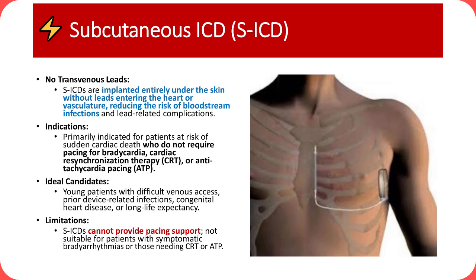However, a major limitation is that they cannot provide pacing support, making them inappropriate for patients with symptomatic bradyarrhythmias or those needing cardiac resynchronization therapy or anti-tachycardia pacing.